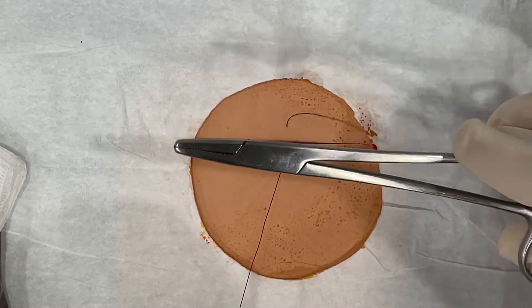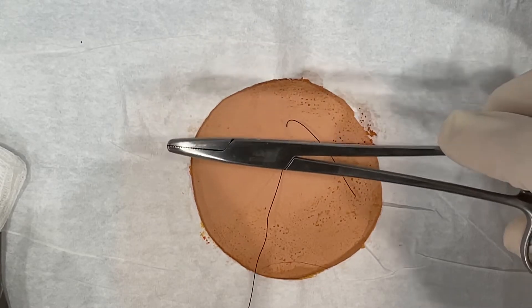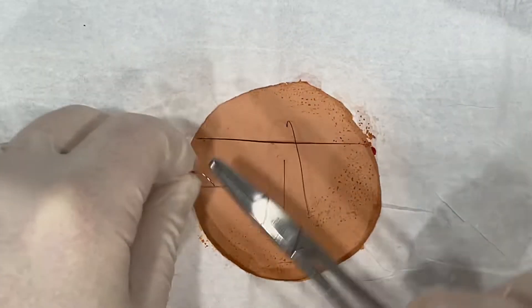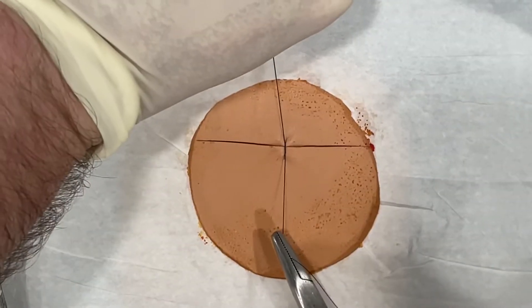Now, with the instrument tie, you want to put your forceps, hemostats, whatever you're using, right over the incision. You make two loops — one, two. Come through, grab the tail, pull across you. That's the first throw.